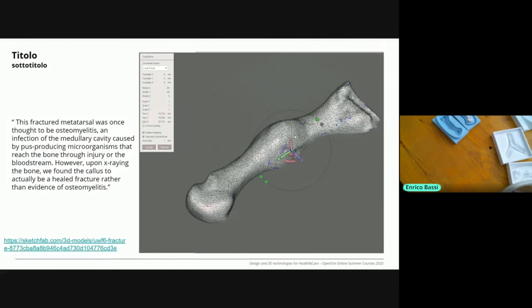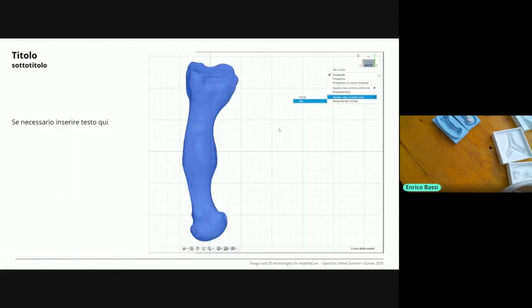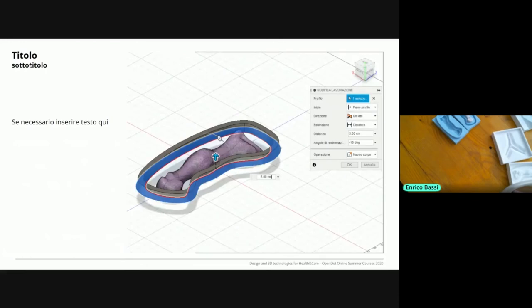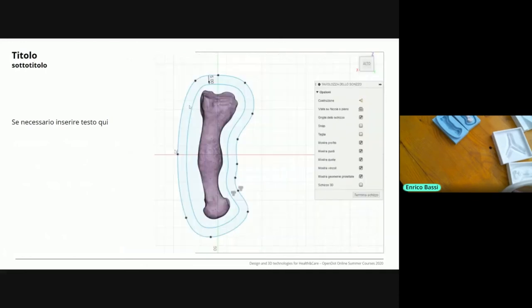In Mesh Mixer, what we do is just to align things properly, check the dimensions, and bring it to 0, 0, 0. So we know that it's properly placed. This allows us to import it. It's an older version of the presentation. Sorry, there's all the text missing. My bad. I will fix this in a second.